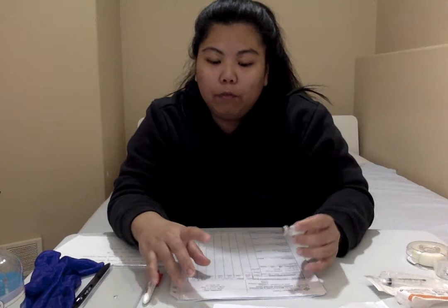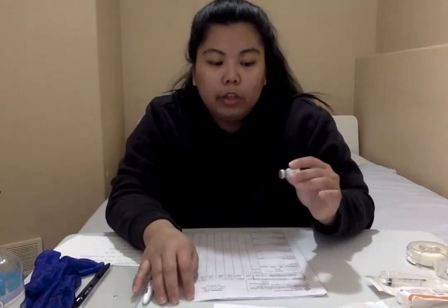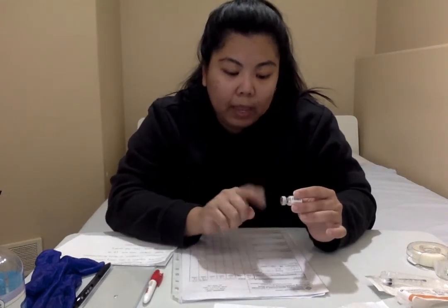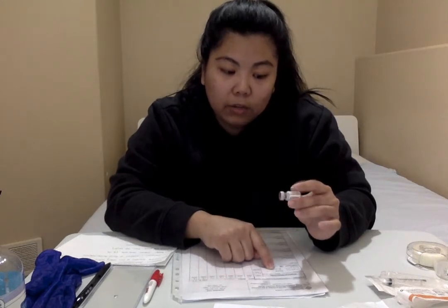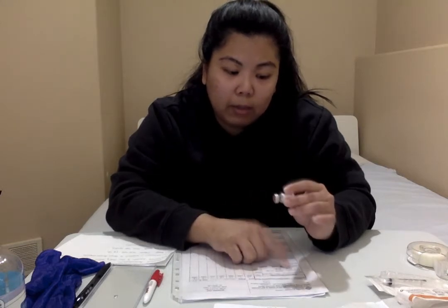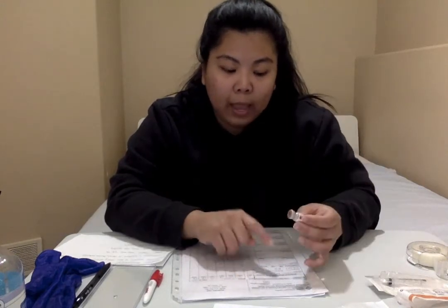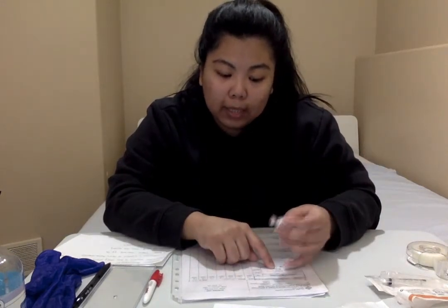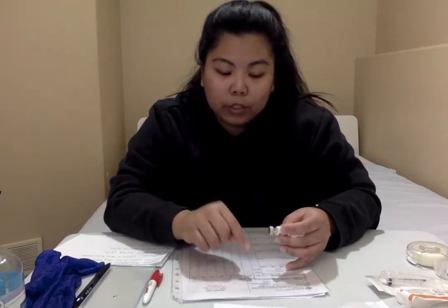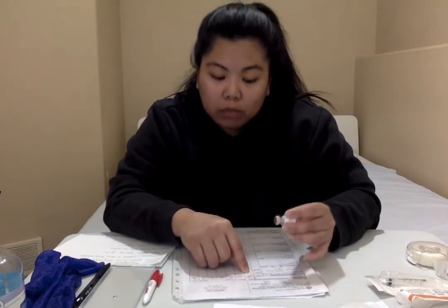So the things that we're looking for are making sure we have the right patient, right drug, right dose, right route, and right frequency. So this medication here is for my patient nursing Jake, and the drug's name is heparin, and the dose is 5,000 units. On the vial it says 5,000 units for 0.5 ml, and the route is subcut. On the vial it says single dose vial for IV or subcut use, so this is safe to be given through subcut. And for frequency, it is twice a day, so the dose is scheduled at 8:30 and another one at 20:30. Currently it's 8:15, and this will be the first time that this patient will receive this medication for the day.